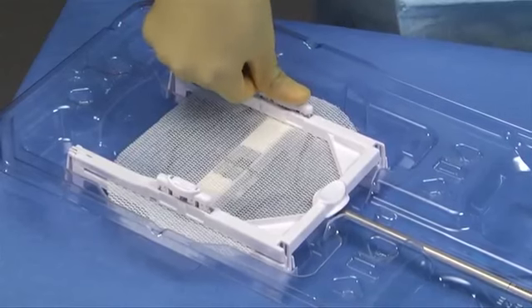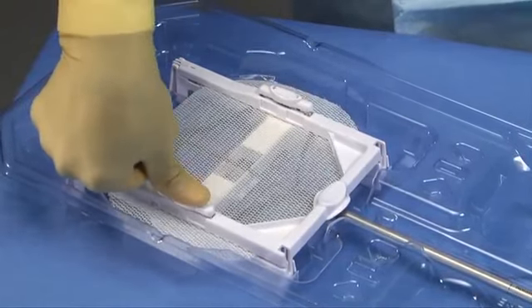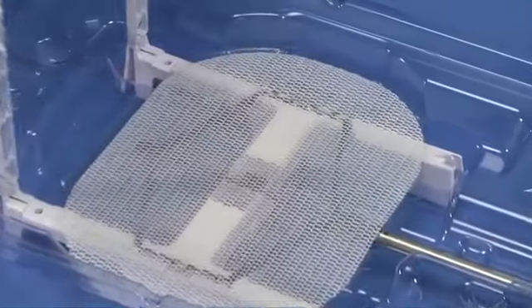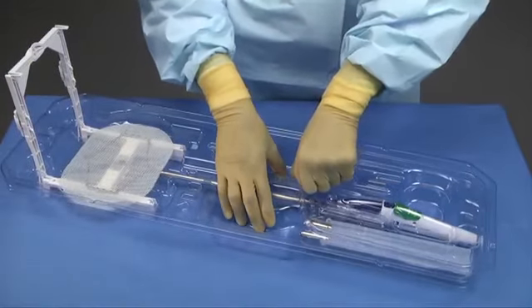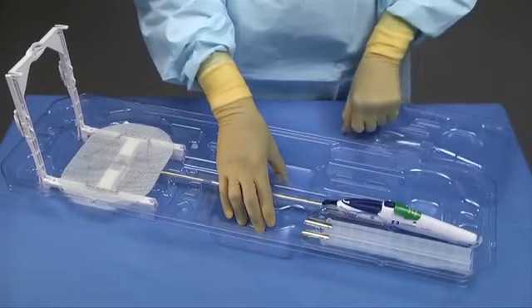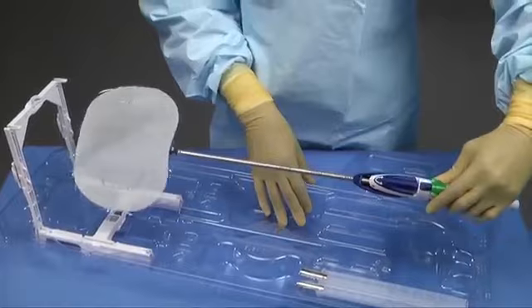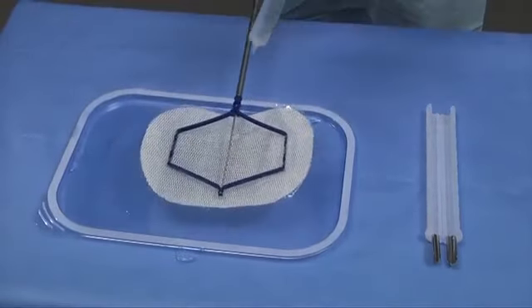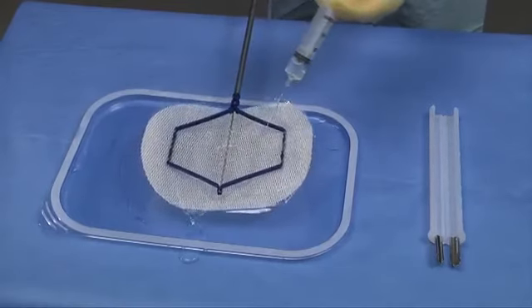Depress the two lateral thumb tabs on the frame to engage the mesh onto the deployment frame. Open the frame and visually confirm the clips are in the down position. Remove the remaining blister and remove the device from the packaging by grasping the handle and lifting upward. Refer to Mesh IFU for specific instructions for mesh preparation, i.e. hydration requirements if needed.